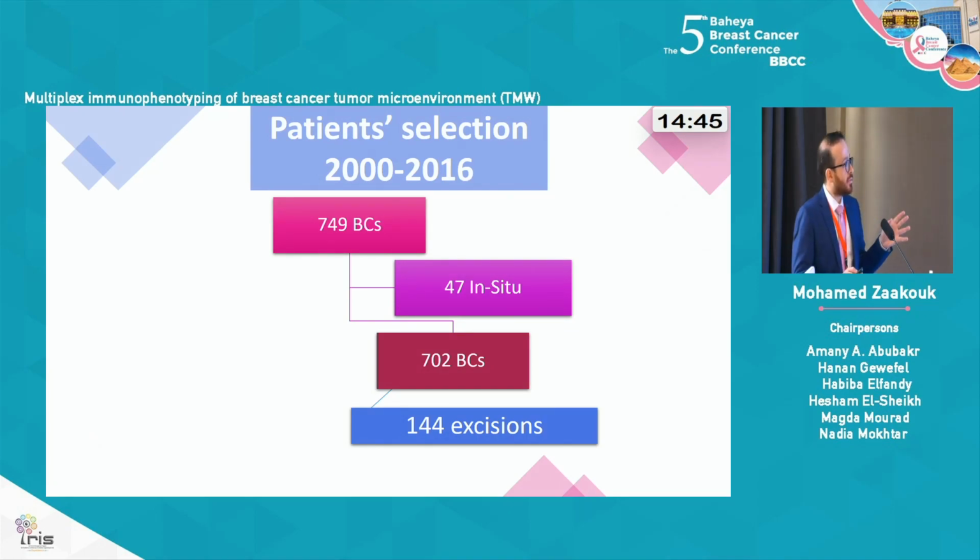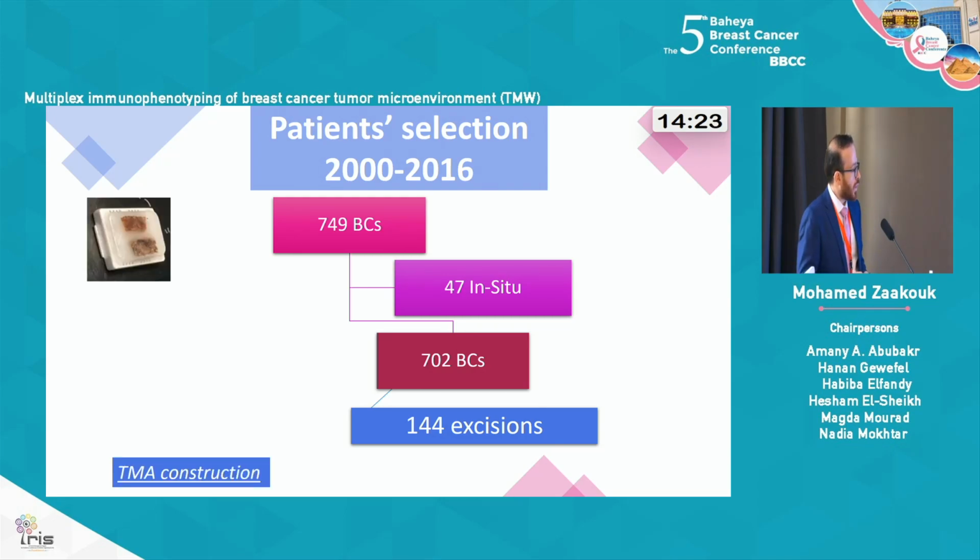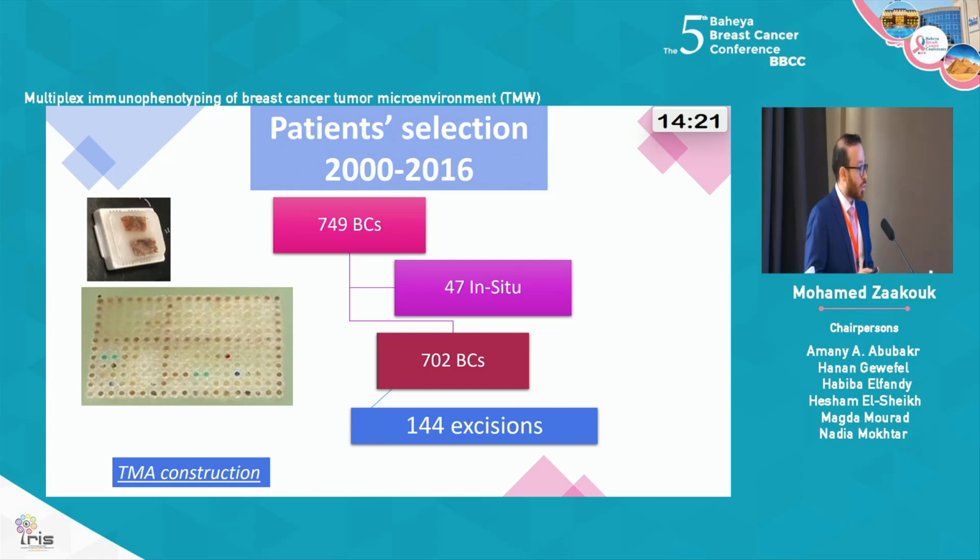We have selected patients diagnosed between 2000 and 2016 to allow for at least a 5-year period of follow-up. We have identified 749 cases, 47 of them were in situ, and the invasive ones were 702. And from them, the ones with available excision blocks were 144, from which we have constructed a tissue microarray.